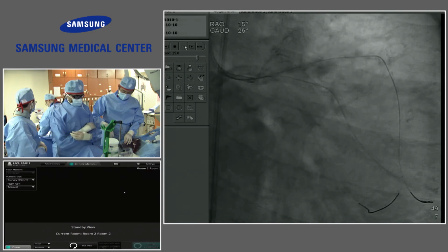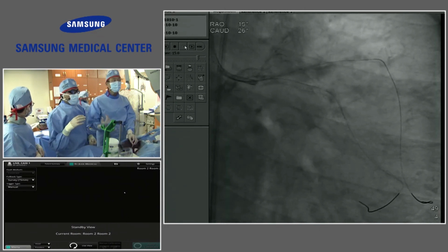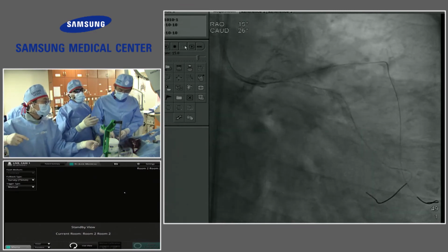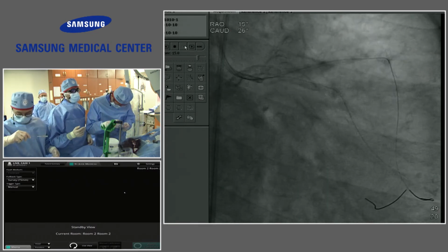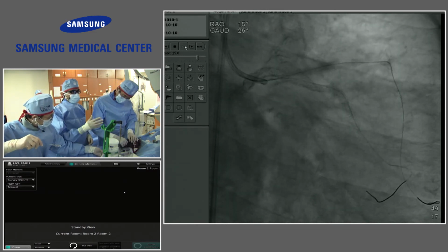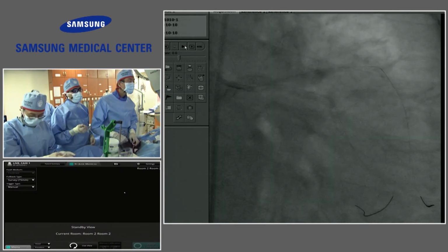So Dr. Ali, you can answer on the timing for the imaging. I completely agree. If your imaging catheter can cross a lesion easily, then it's worthwhile taking an image. But really, lesion preparation is as important for imaging as it is for stent placement. So we agree with you that the next step, if we were going to rotablate, should not be imaging. We would rotablate first, then image, then help us decide size and dimensions of our stent.